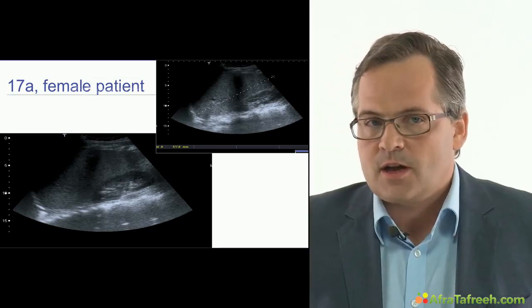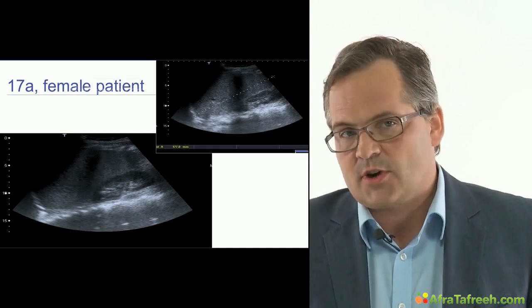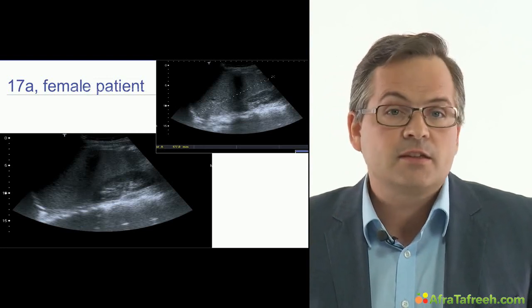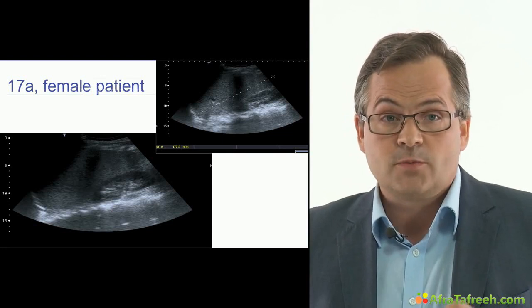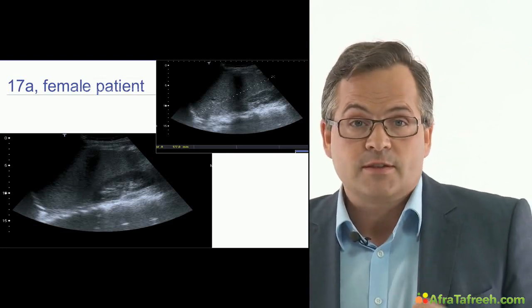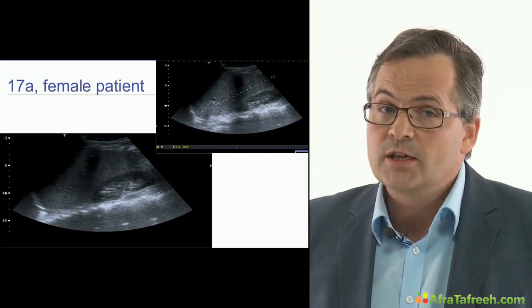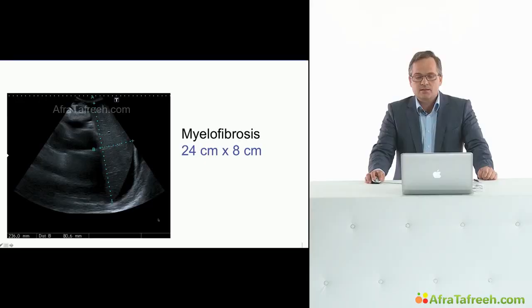In this particular example, spherocytosis was diagnosed with an increased destruction of erythrocytes, which led to gallstones and an enlarged spleen. Before splenectomy is performed, it's necessary to vaccinate against certain bacteria and to inform the patient that after the operation there will be some degree of immune deficiency. Let's see some other reasons for a massively enlarged spleen.